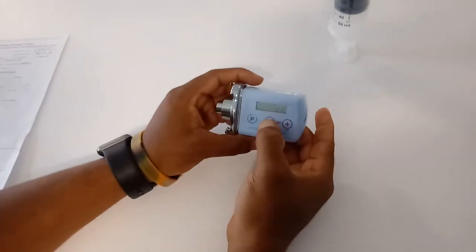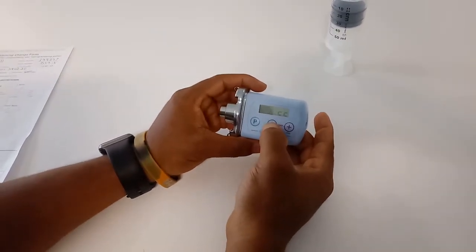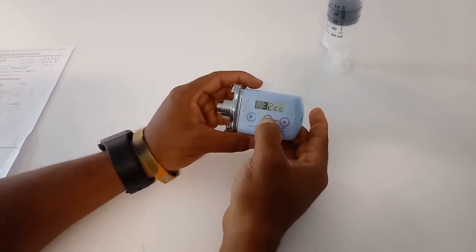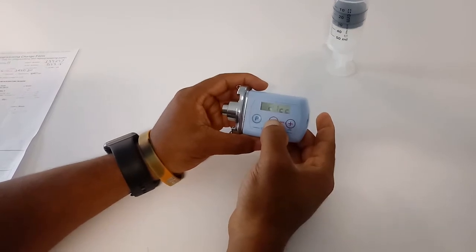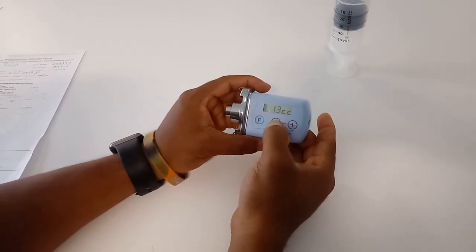Okay, now it's 50 here, and I'm going to go down to the volume that I really want. In this case, I want 12 cc, so I'm going to keep hitting the minus sign until I get to 12, and then I'm going to stop. So I'm going to go a little bit fast so we can get to 12 quickly. Keep hitting the minus sign until you get there. Now we're getting close. Now here I am.